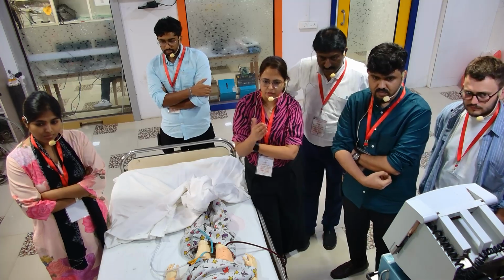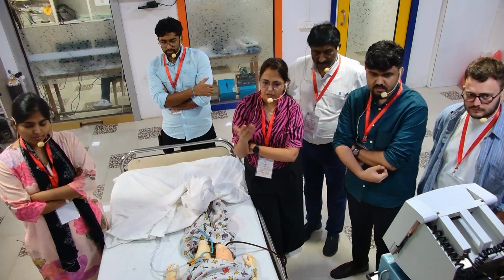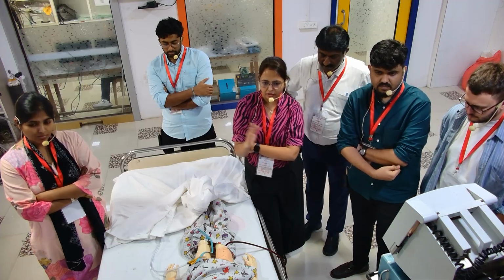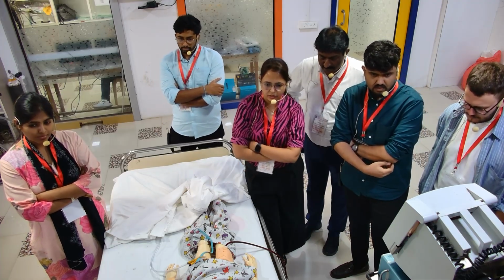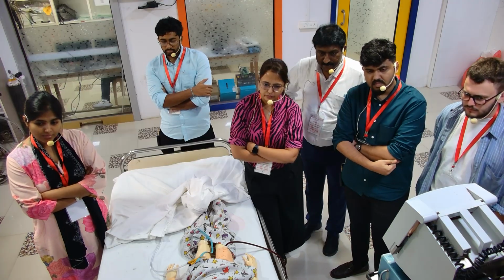So the negative pressure of the pump was not getting transmitted to the vessel wall. Generally, chattering happens because the vessel wall gets abutted to our cannula tip and then released. So intermittent suction and release of the vessel wall leads to chattering, but it was not in our case. So again, that rules out your hypovolemia side. Okay. Third thing, was it sudden or gradual?